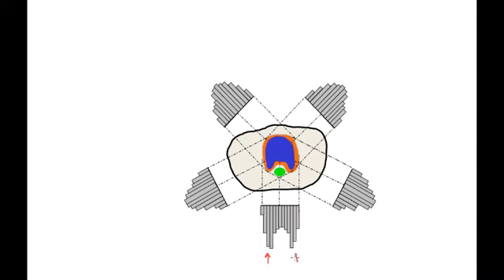And what you'll see here, if you look at this bottom beam, is that we have within a single beam some regions that are very hot, high dose, and some regions that are very cold, like in the middle. It has a cold region. And you can see that you need that cold region in the beam to spare the OAR in this case. So this distribution is uneven within a single beam, and it's called intensity modulation, the modulation of the intensity or the fluence or the dose within a beam. And that's where IMRT gets its name, intensity modulated radiation therapy.